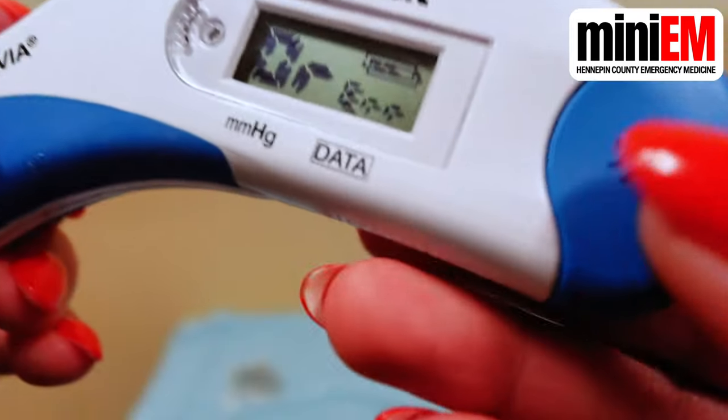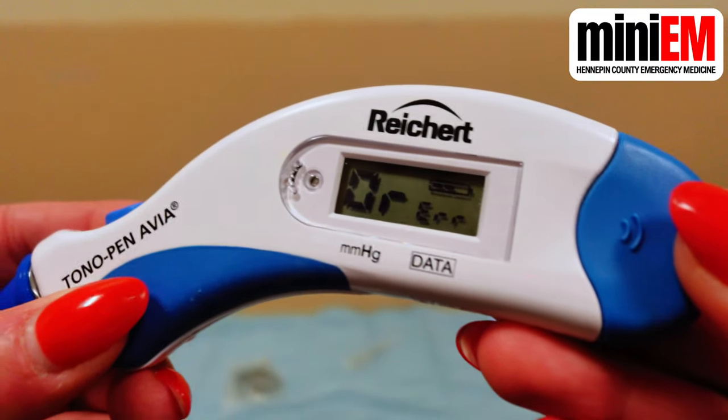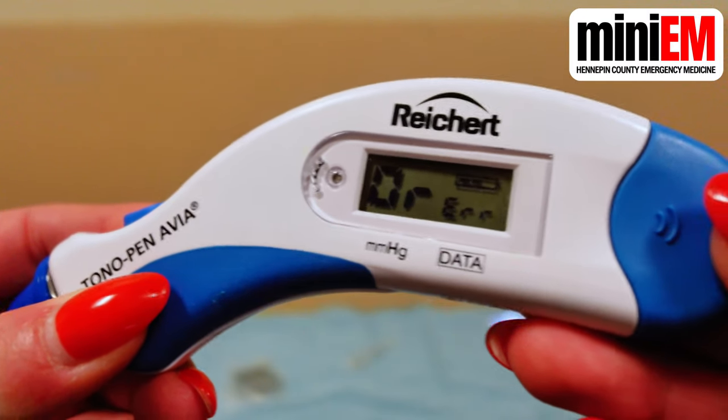If it reads OR-ERR, that stands for over error. That might actually mean that the measurement is so high that the machine can't calculate the intraocular pressure. If that's the case, you want to consult an ophthalmologist ASAP because it means you probably have a very high pressure.